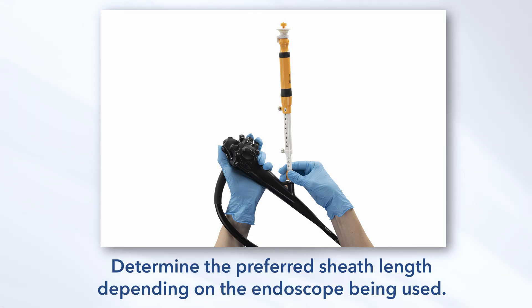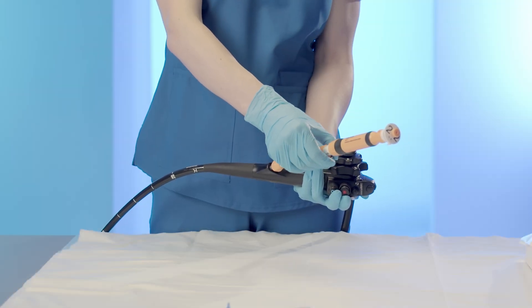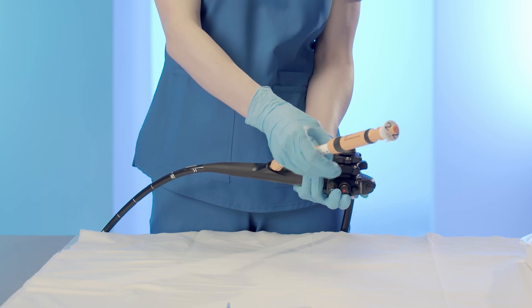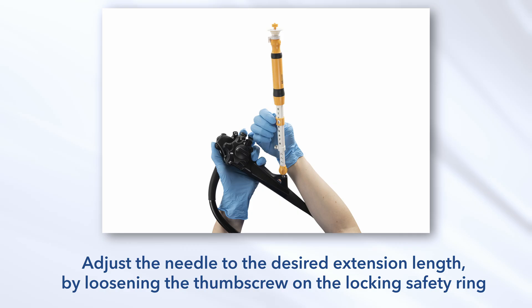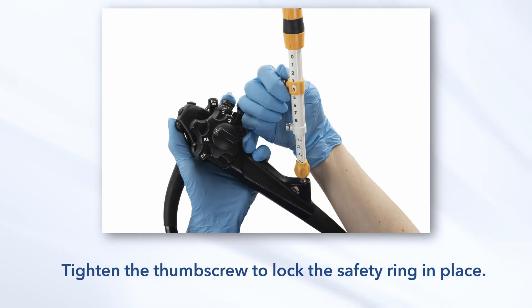Adjust the sheath and needle length. Determine the preferred sheath length depending on the endoscope being used. Loosen the thumb screw lock on the handle sliding member and slide until the preferred length is attained. Tighten the thumb screw to maintain the preferred sheath length. Adjust the needle to the desired extension length by loosening the thumb screw on the locking safety ring and advancing it until the desired reference mark for needle advancement appears in the window of the safety ring. Tighten the thumb screw to lock the safety ring in place.